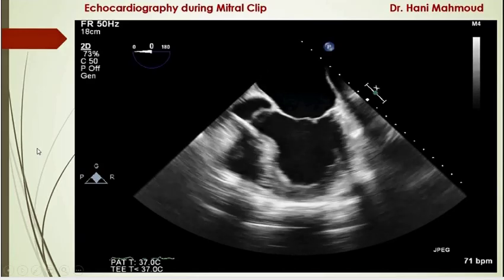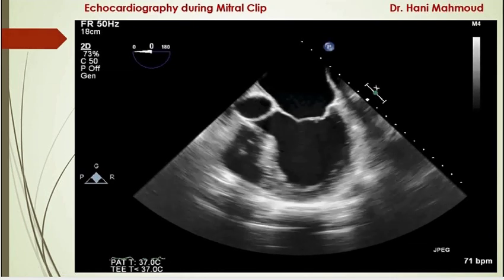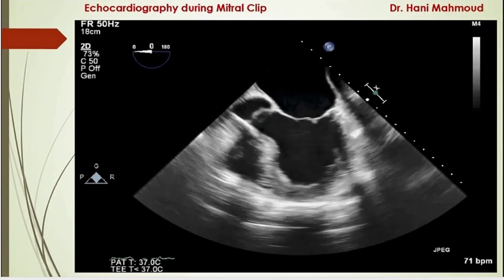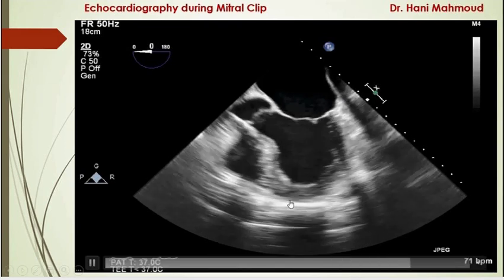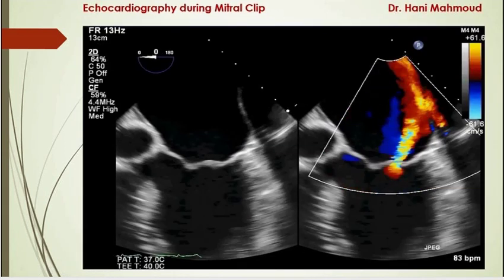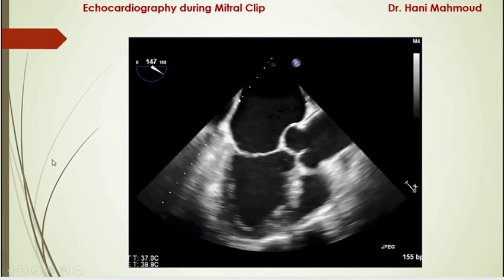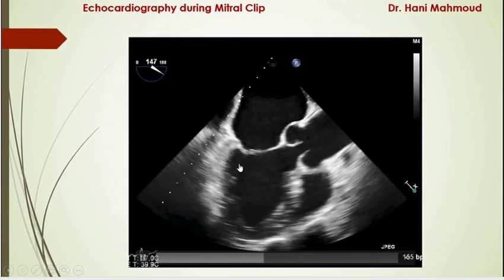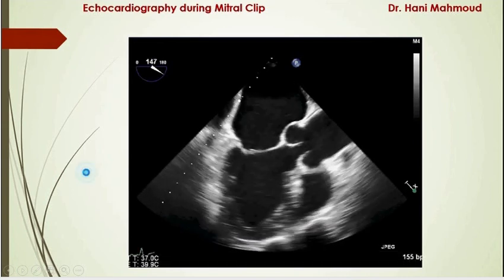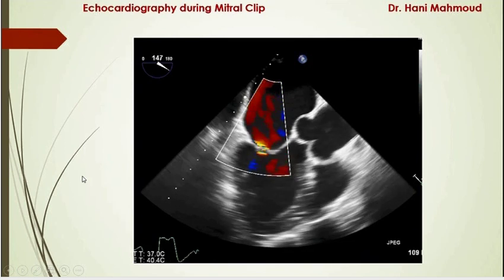The echocardiography role during clip procedures will start by taking some basic measurements like vena contracta, pulmonary vein reversal of flow during systole, and most importantly, we have to exclude the presence of a pericardial effusion. In this patient, we have a severe jet of eccentric MR. The mechanism of this MR was due to tethering of the posterior leaflet with some annular dilatation, producing an eccentrically posteriorly directed jet of severe MR.